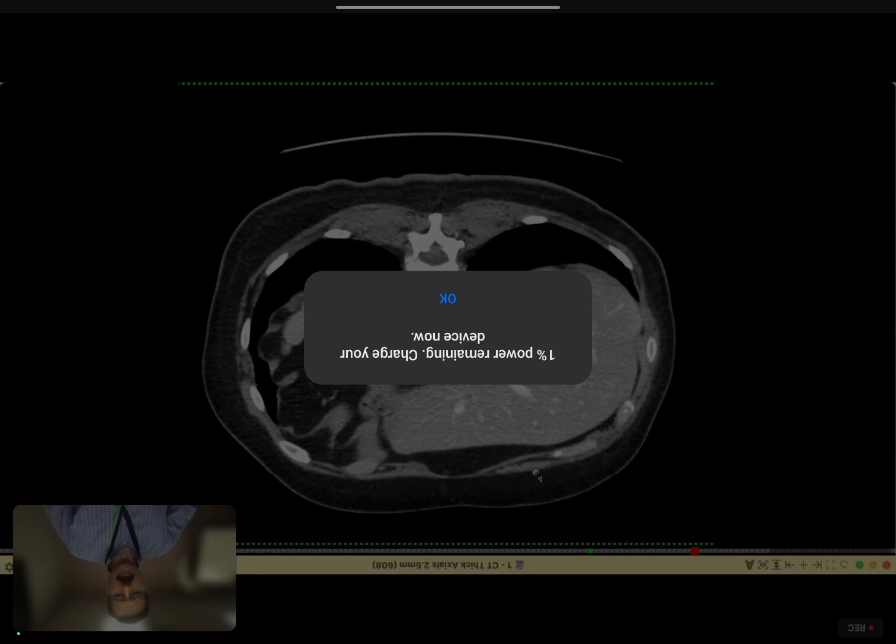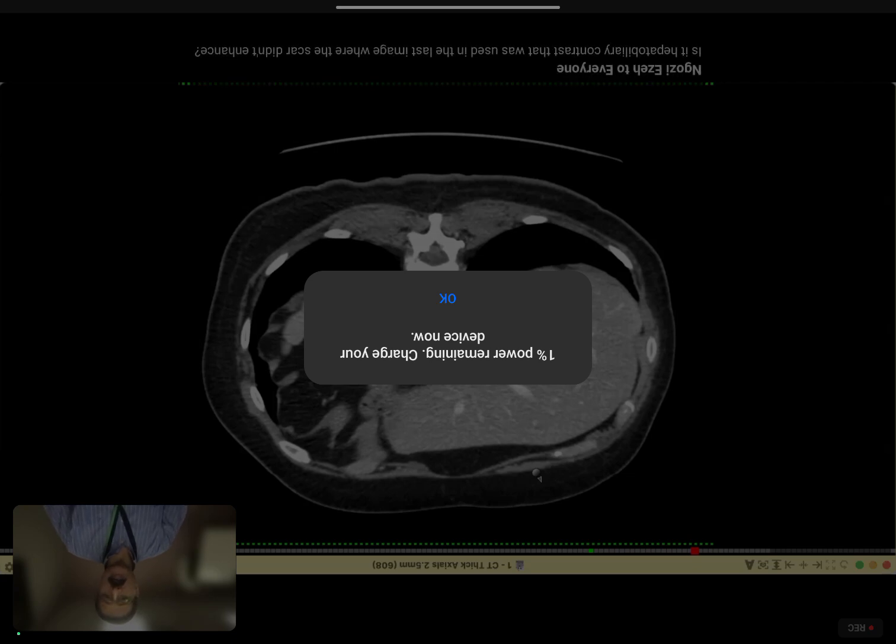If there are normal hepatocytes, it will show high uptake on the hepatobiliary phase. An HCC will not have normal hepatocytes. A metastasis will not have normal hepatocytes. Now we have started using hepatobiliary specific contrast in cirrhotic nodules, particularly if there is a suspicion of HCC. And as a routine in difficult cases, we use this because it will be a filling defect.